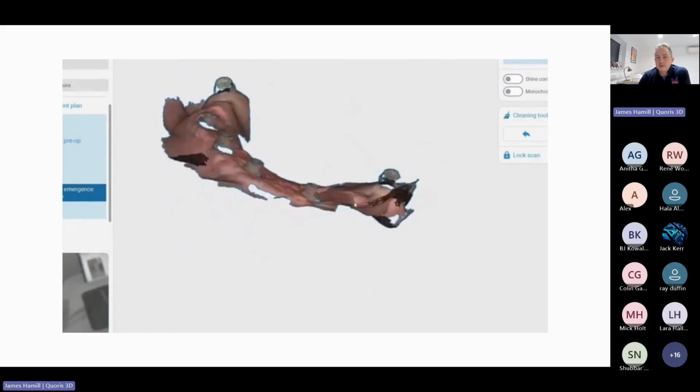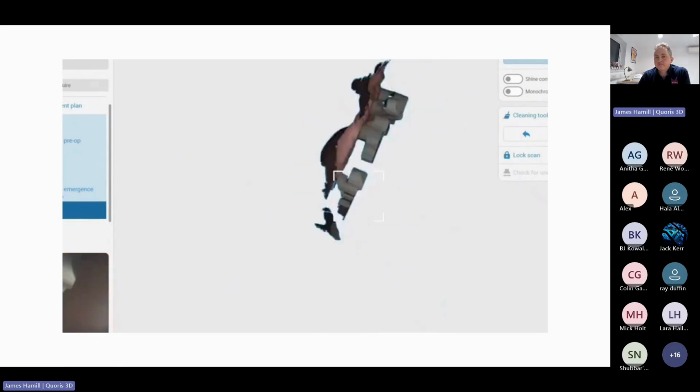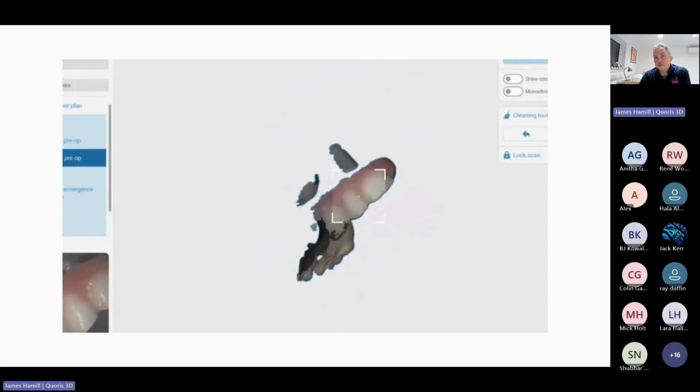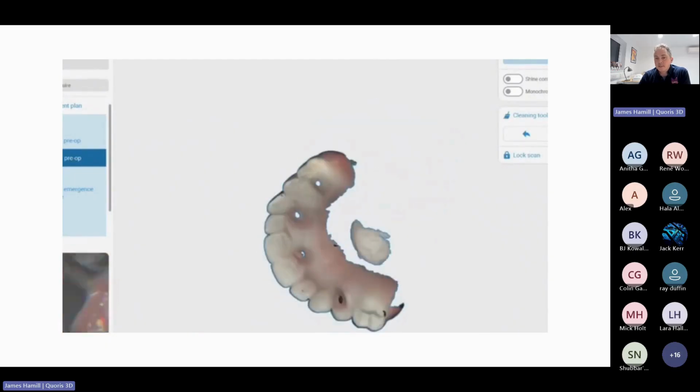And here should be the scan bodies. So that's the arch bridge scan bodies. And this is the 360 of the bridge. This is often the hardest scan to capture, and it can take a little bit of time.